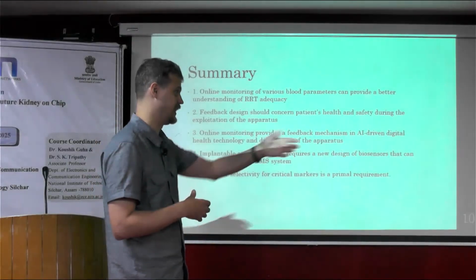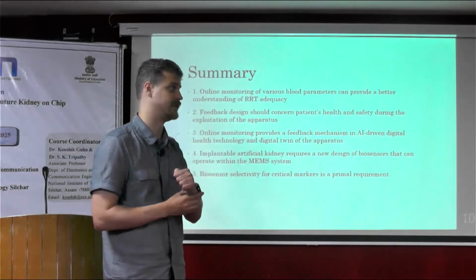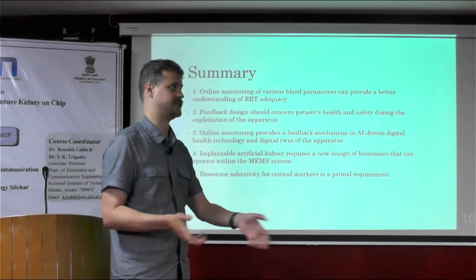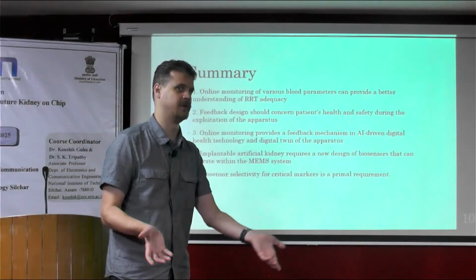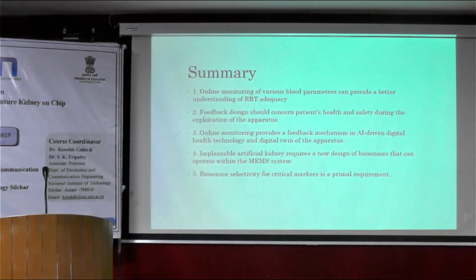It could be molecular parameters like glucose concentration and urea concentration. We also have to control the ultrafiltration flow. What I did not mention during this lecture is that we need sensors that will monitor the blood flow and the ultrafiltration flow within the microfluidic system.